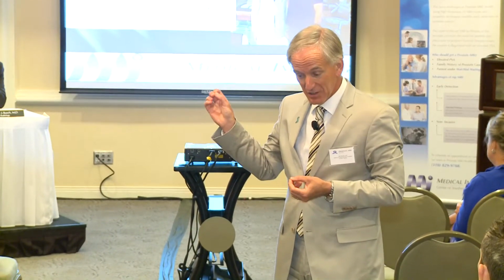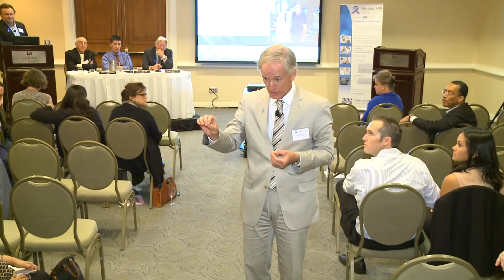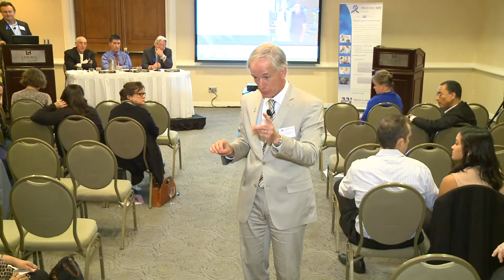Yes, in the trial I showed to you, we missed 5 very bad significant cancers with the combination of MR imaging and MR direct biopsy. Only one of them was a PI-RADS 1 to 3. That was a mucinous carcinoma. That's a cancer with a lot of fluid, and it's very difficult to recognize those tumors from normal tissue. Perhaps with growing experience we will. I'm collecting those tumors now, so if any radiologist has a mucinous carcinoma missed on MRI, please give it to me, because we need to write an editorial or an educational paper on that. The other 4 were PI-RADS 4 and 5, which were negative on biopsy, and we did not re-biopsy because the protocol did not allow. So I think, again, that emphasizes the fact: never trust a biopsy on a PI-RADS 4 and 5 lesion.